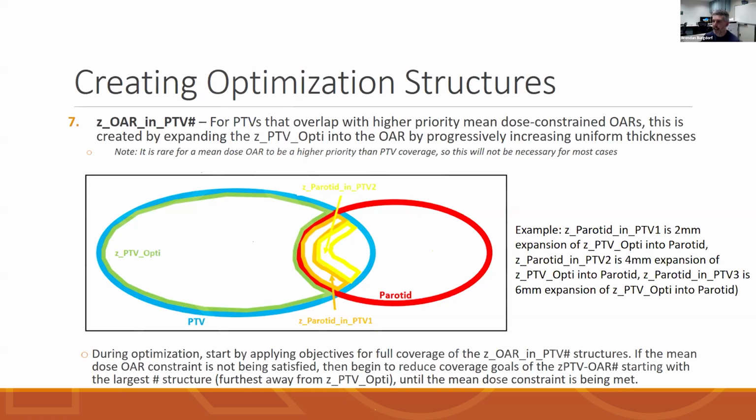Sure. Yeah, and I will add to that, it probably seems like a lot of setup before going into actually planning, but I think that it's an overall benefit because you can take all this time in the beginning to set all these structures up correctly and set your optimization up the correct way. And the benefit of that is you only have to run the optimization one time, compared to if you don't use structures like this and you're just trying to guess at how much sparing you might be able to achieve. It'll take multiple runs of an optimization to be able to achieve that. So I think while it does seem like a lot, there will be a payoff in terms of saving time and creating a great plan if you just take the time to set this up and set it up in this way.